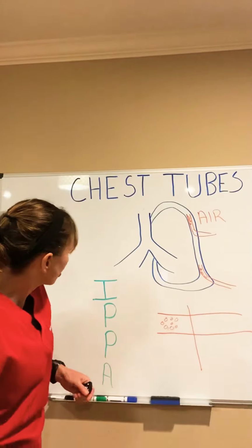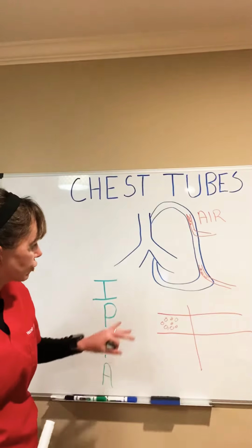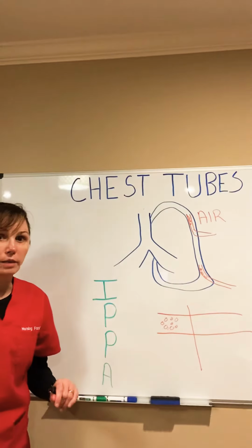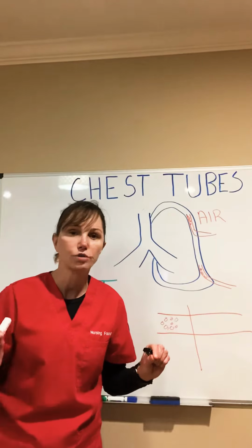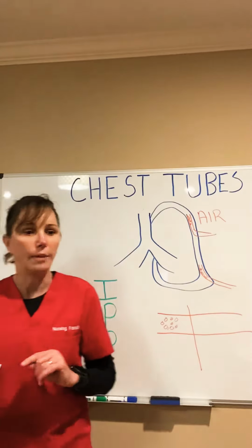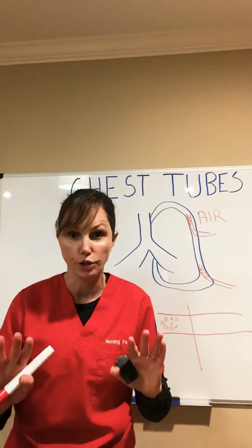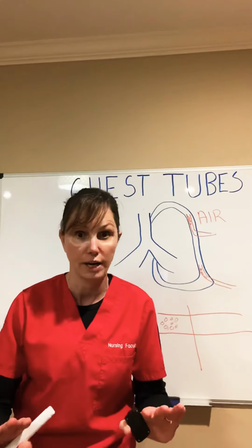Okay, in terms of palpation, when you come on shift, when you change your dressing or you're looking at it, you're going to feel around the chest tube site. What you're looking for is something called subcutaneous emphysema, also described as crepitus. So you might see either of those two terms in the literature. It feels like very fine popping under your skin, okay? This means there's some air escaping around the tube. So if it's a new finding, that's significant. Assess your patient and let the provider know, okay?